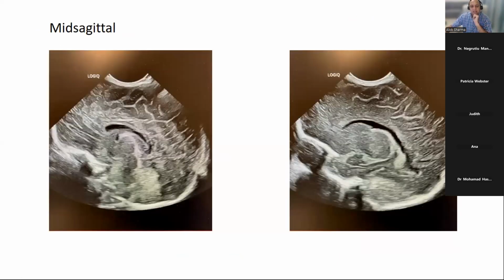So a very nice image. And really from your perspective, you can see the anterior, the cavum septum pellucidum. Towards the back here, you've got what is called the cavum vergae. So I'll just outline it for you. So this is the cavum septum pellucidum, and this is the cavum vergae that you see at the back over here. Interestingly, it disappears. It's very small. It's just a remnant at 28 weeks in this baby, so it's not really well visualized when you go to the posterior views, but very, very nice.